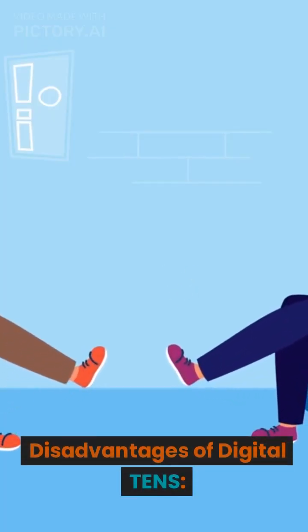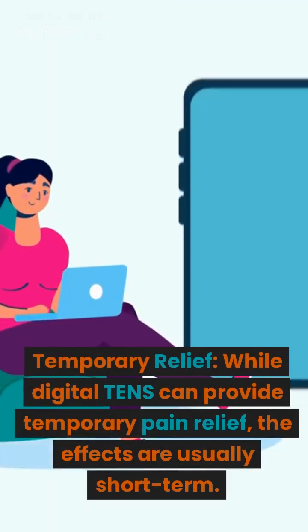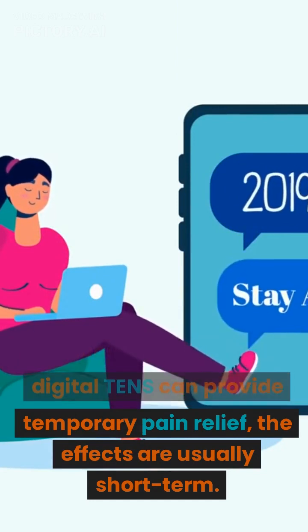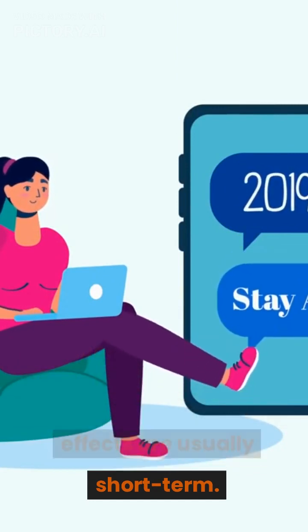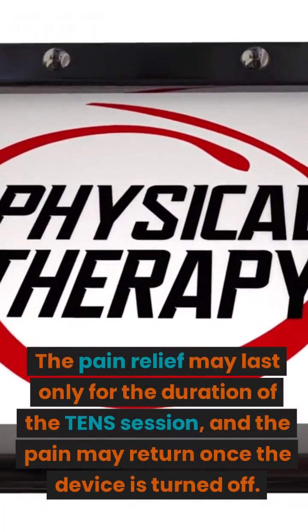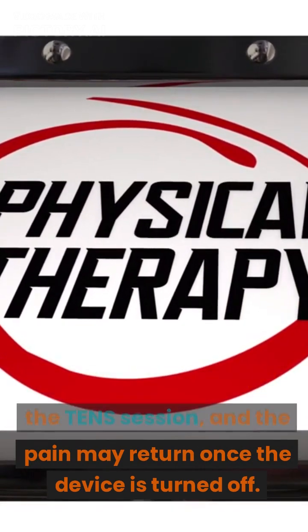Disadvantages of digital TENS. Temporary relief. While digital TENS can provide temporary pain relief, the effects are usually short-term. The pain relief may last only for the duration of the TENS session, and the pain may return once the device is turned off.